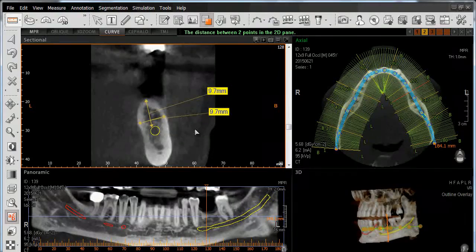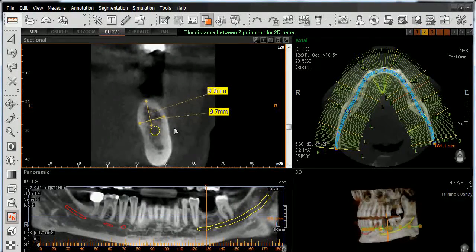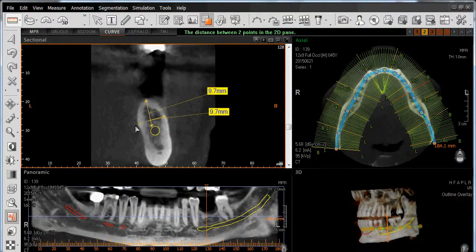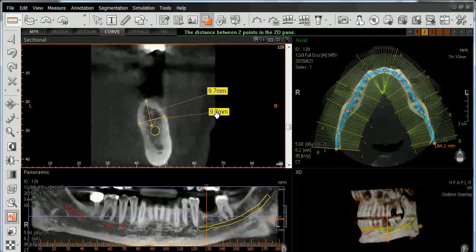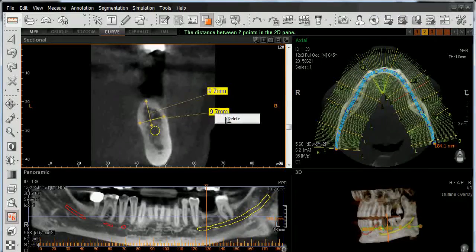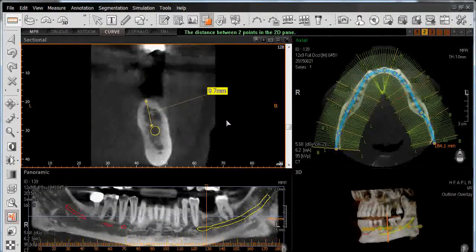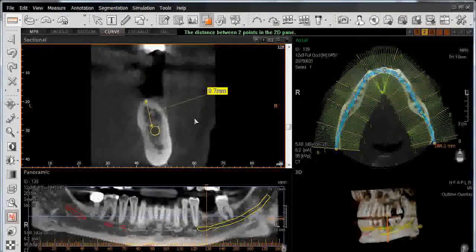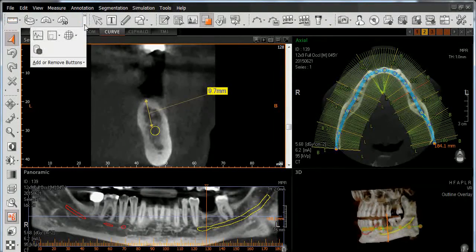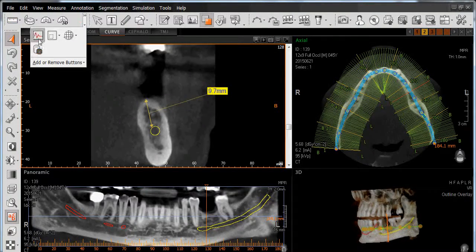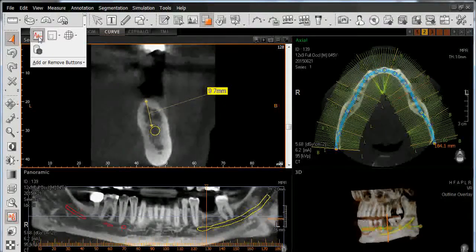If we also want to measure and assess the bone quality where we're going to place our virtual implant, let's delete this measurement and do a profile measurement instead. I'll right-click, select delete, and now I've removed that measurement. We'll navigate to the toolbar and left-click on the icon that says profile.